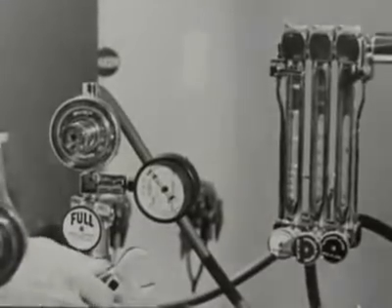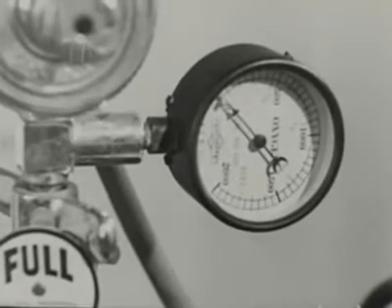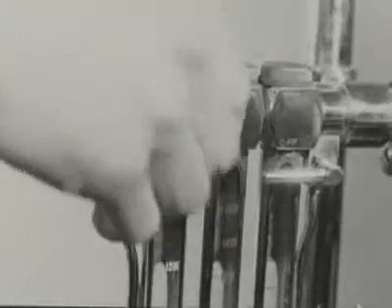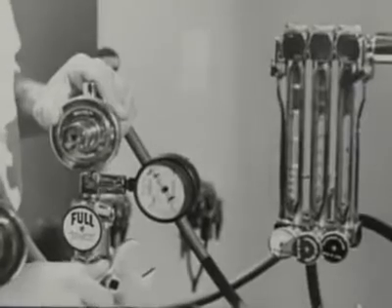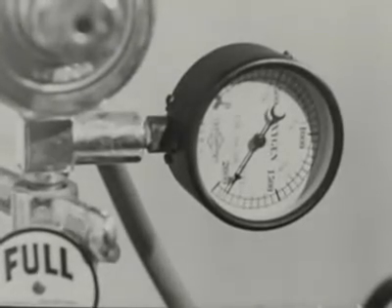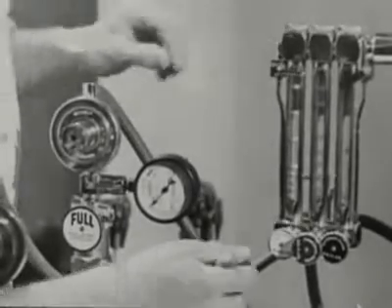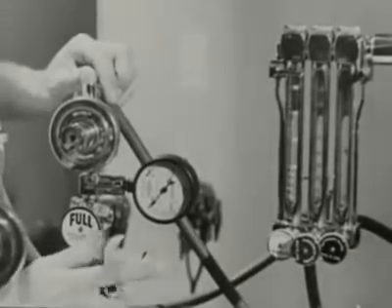Now make sure that the cylinders are full. Don't trust the labels. The oxygen is in gaseous form, so the cylinder is supplied with a pressure gauge which indicates the contents. Before opening the cylinder, turn on the bypass tap to avoid any sudden strain on the pressure gauge. Turn the full or reserve cylinder key and read the pressure gauge. This confirms that the cylinder is full. Turn off the bypass tap and test the flow meter. Now turn off the cylinder.